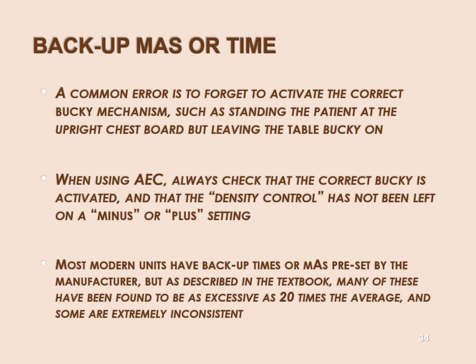All right, so in some of the older units, you can activate the table bucky mechanism when you're at the wall bucky. Now the newer equipment has a safety lockout and won't let you expose. Okay, it can tell if you fed a cassette into that bucky.